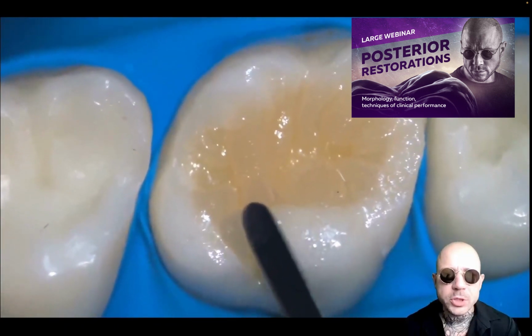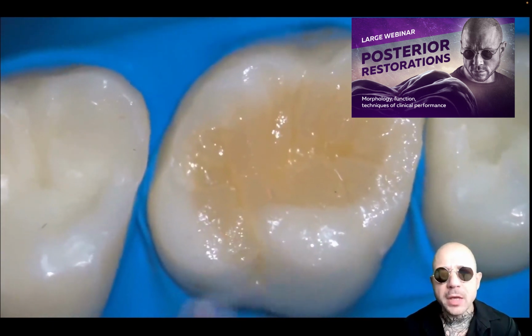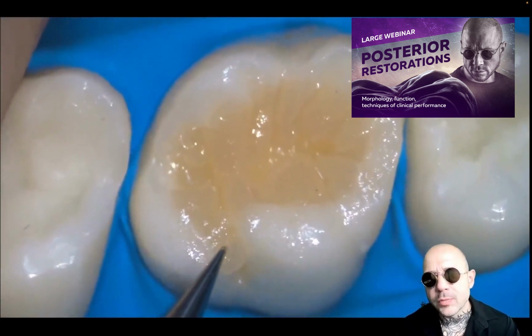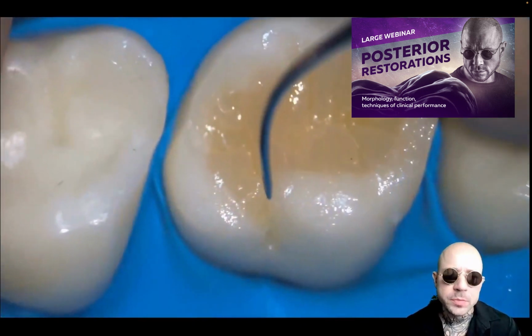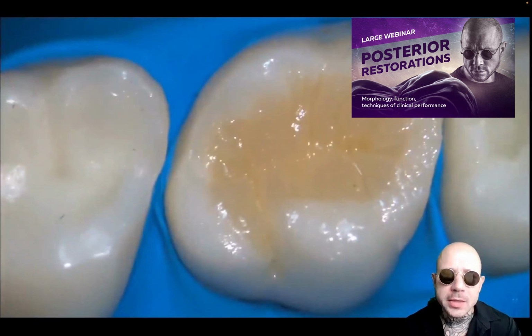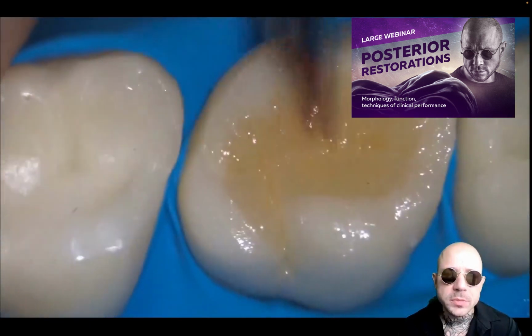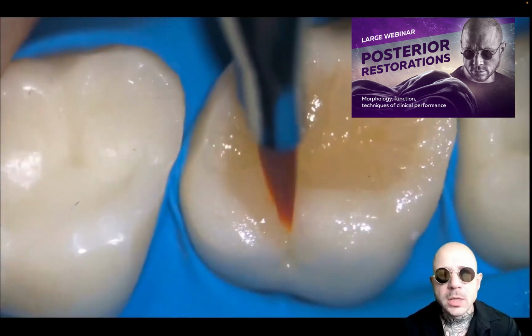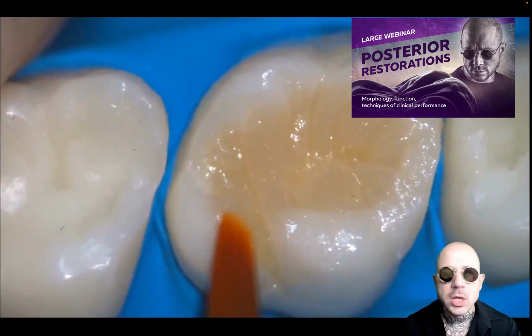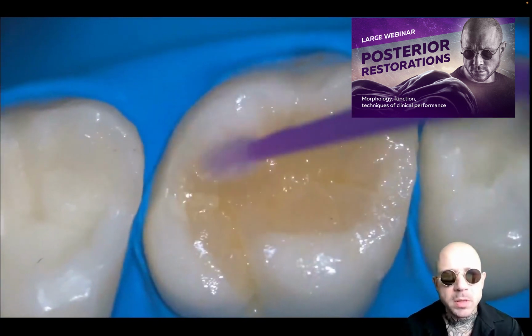And the last side ridges of the distal palatal cusp. Keep in mind that their position is limited by that obliquely running main palatine fissure. Do not exaggerate the length of those distal palatine ridges. It's a quite widespread and very frequent mistake, as I can see in the works of many doctors posting on Facebook or Instagram.